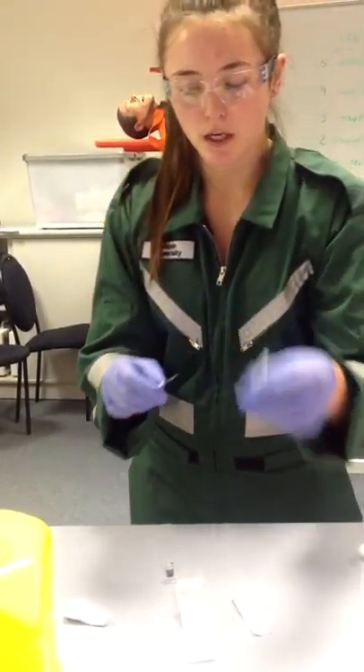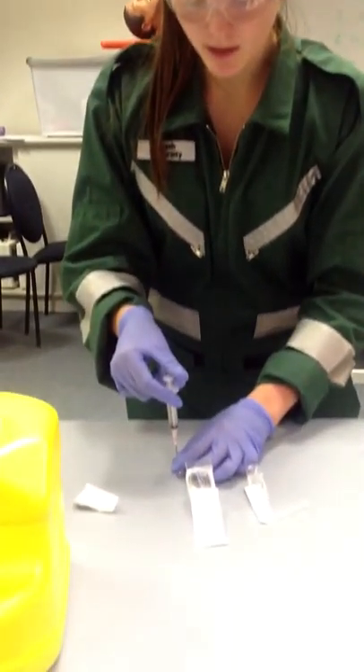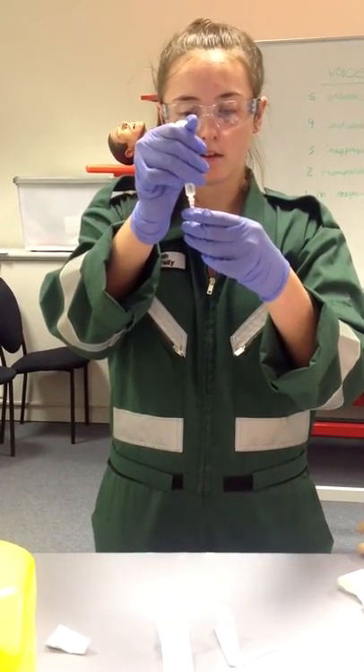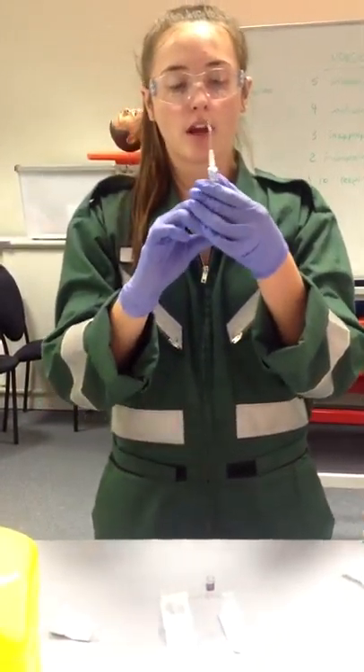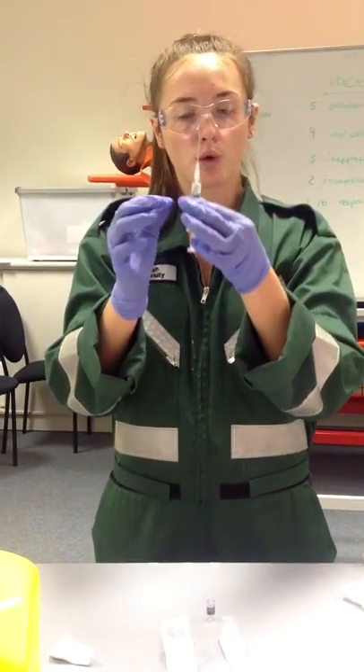I'm going to pull the cap off the end of my needle — non-sharp end — and insert that into the jar and slowly pull the drug out. I'm then going to check I have no air bubbles in the drug. That's all good to give.